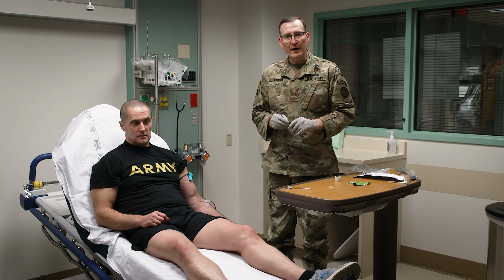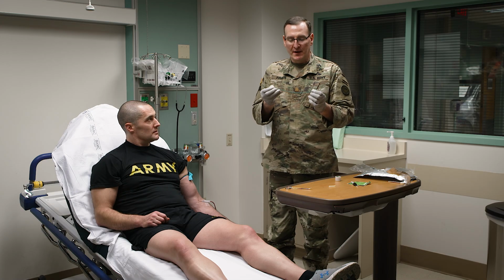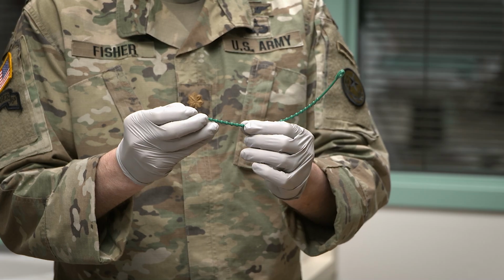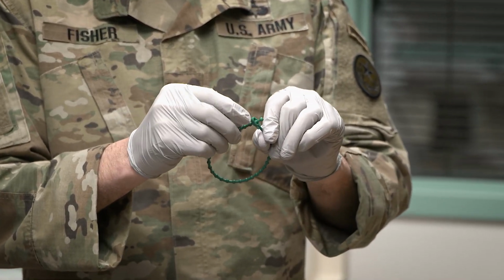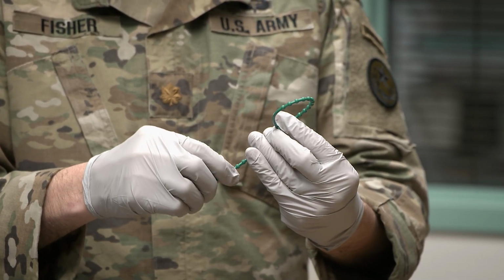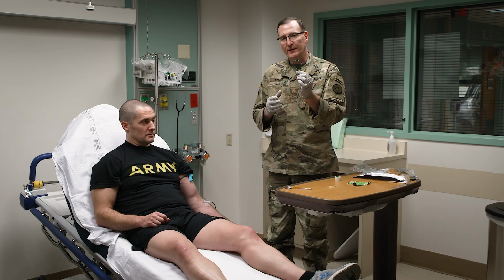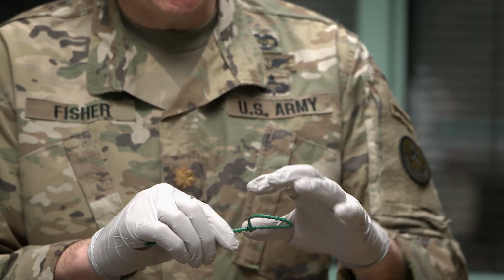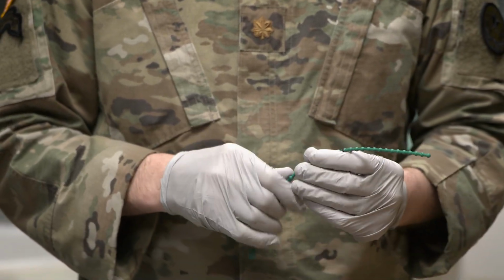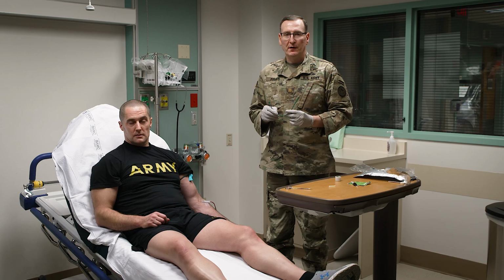Next thing I want to do, if I don't have that available, I can use what we usually call a beaded cable tie, and I can put this at 6.5 inches. Most of the kits that are available commercially now do come with a marked area on the beaded cable tie to where I need to place it. So I'm going to place this around the long axis of the bag, slide it down until it gets to the mark, and that will restrict the amount of blood that can go into the bag, therefore not allowing it to overfill. Overfill can be hazardous because it could cause clotting in the blood bag. It could also cause too much blood versus the citrate ratio.